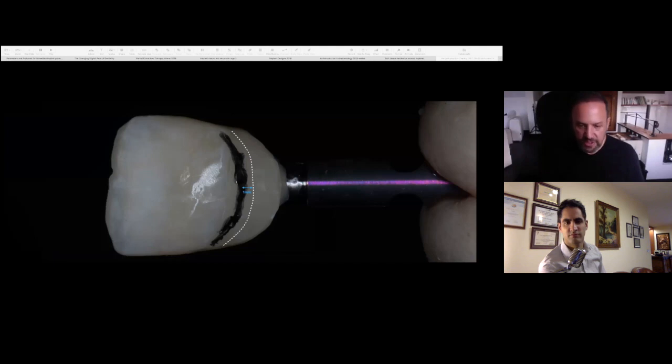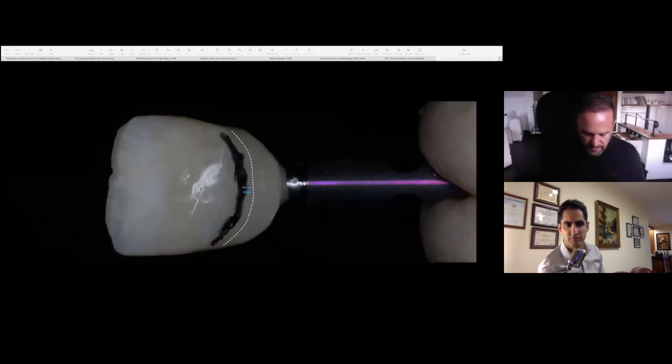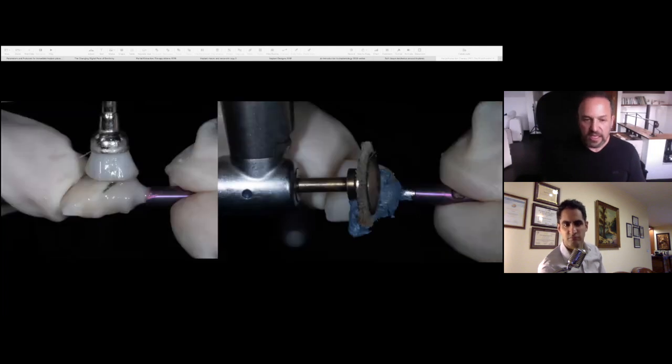So here, I'm just going to go back there. Sorry, let me go back here. So from there, what I can now do is I can now contour and take away, and this is in 3 dimensions, so it's also happening on this portion as well. Okay, so we then polish it up very, very well. In this case, I used 3 first pumice, then I used 3 different diamond pastes up to, I think, 0.3 micron diamond paste. We highly polish it.